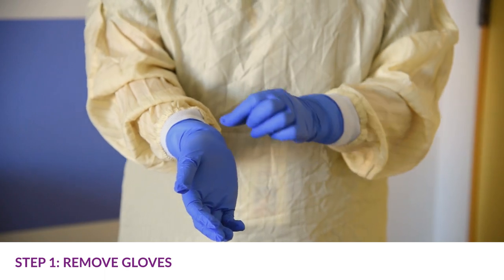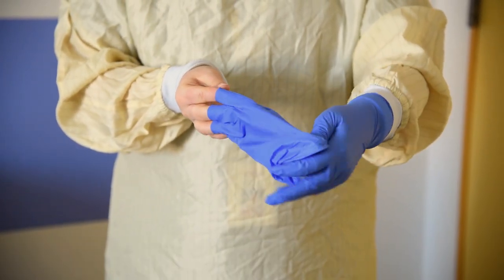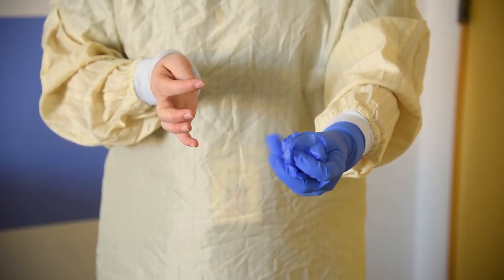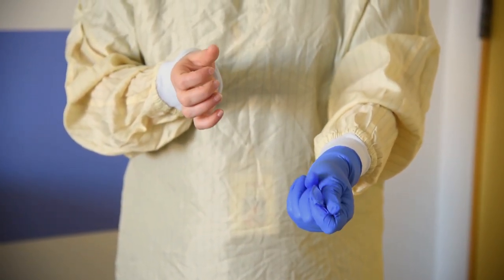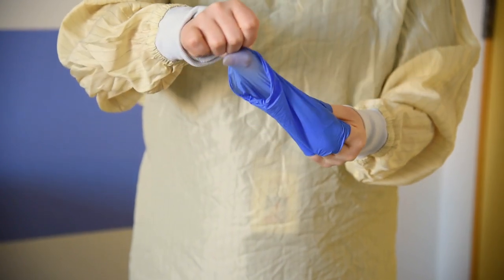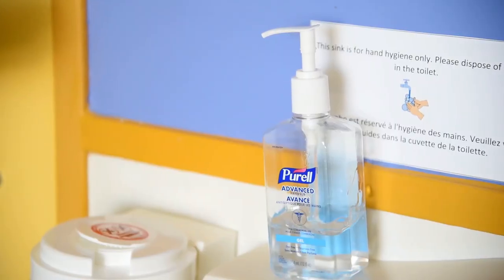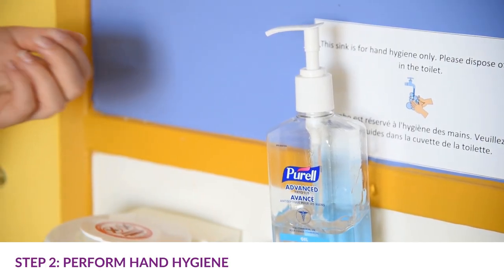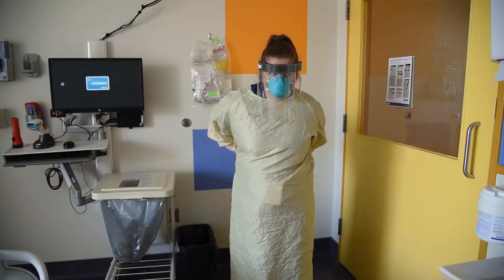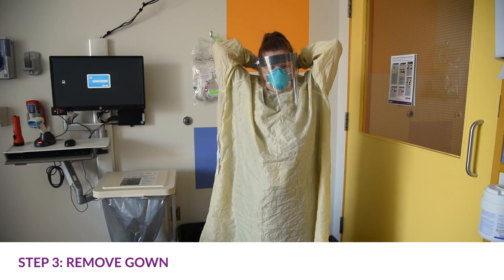Grasp the outside edge of the glove near the wrist and peel away from the hand, turning the glove inside out. Hold the glove in the opposite gloved hand. Slide an ungloved finger or thumb under the wrist of the remaining glove, peel the glove off and over the first glove, making a bag for both gloves. Put the gloves in the garbage and perform hand hygiene.